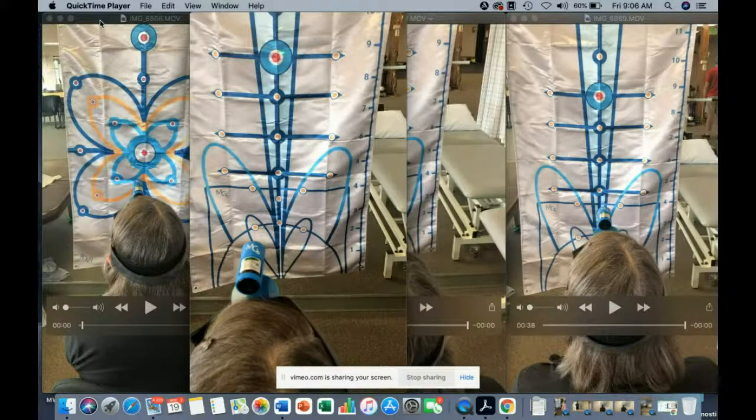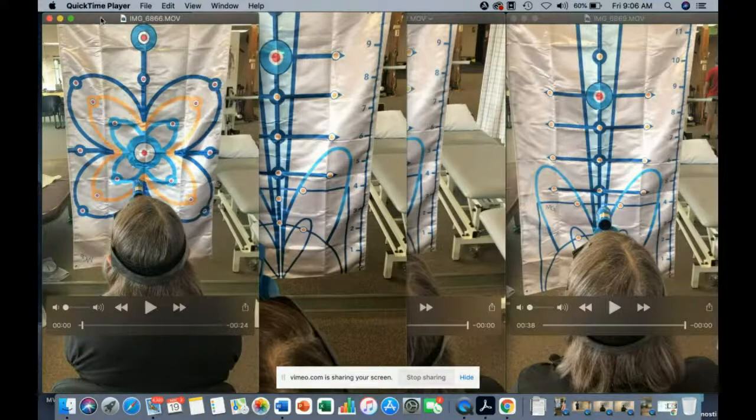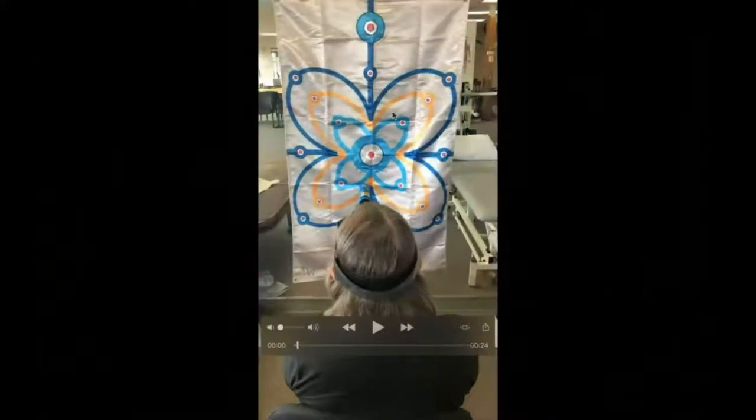She does have some fixation issues on testing. And so we got her in front of the target here. I standardize everything in my facility at 5 feet because that joins with the joint position sense error testing that I do using the motion guidance system with the maze flag that comes in the clinician kit. But this was her initial assessment. So let me magnify this and we'll see how she was doing.